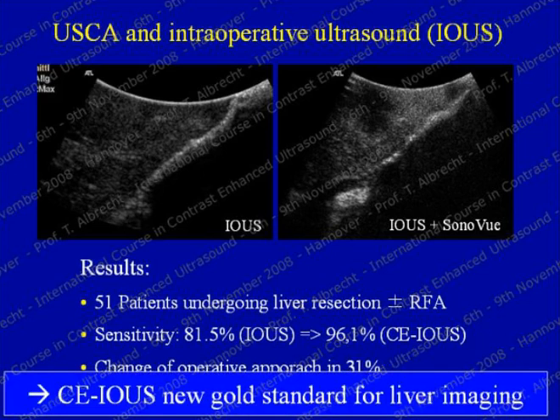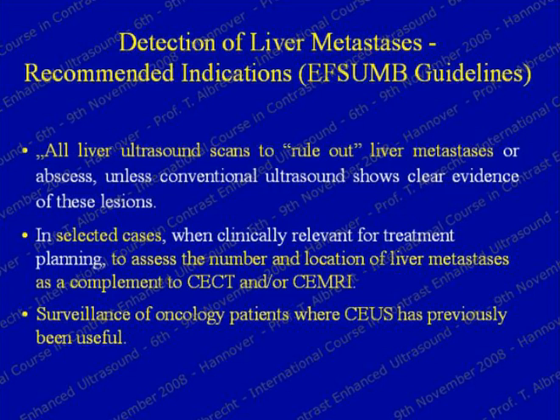So we really have, and I very strongly believe this, a new gold standard for liver imaging, and that is intraoperative contrast-enhanced ultrasound. The EFSUMB guidelines have recommended indications. Edeline's already shown them, so I'll keep this very short.